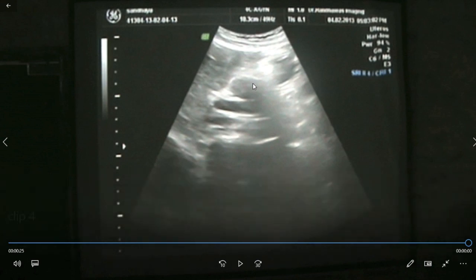So this was a briefing about the CBD along with a practical demonstration about focusing. We showed you some still pictures as well as videos, and once you combine all these, I think the focusing should be very easy for you. Thank you.